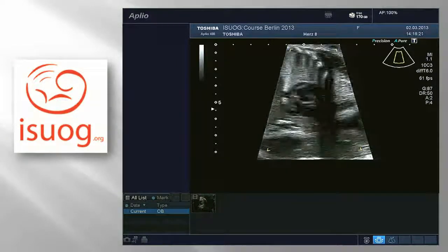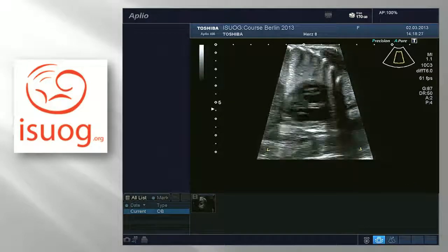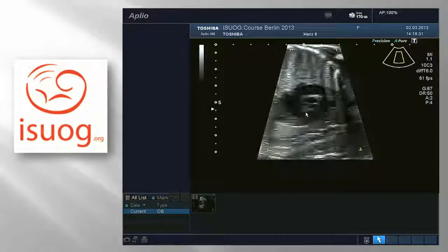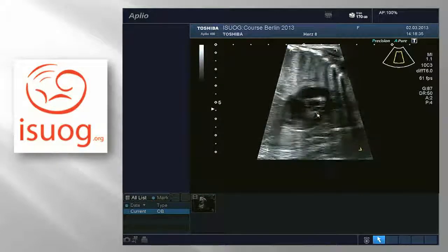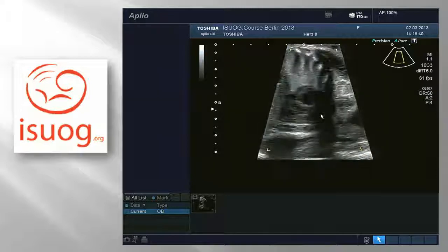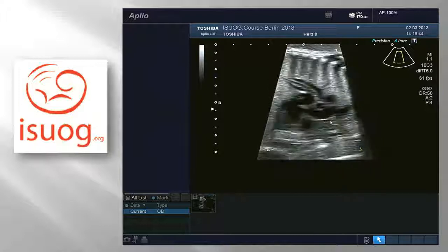So we have the short axis through the valves going to the papillary muscles of the left ventricle. There are two of them, nicely placed here. The right ventricular outflow tract. And then with a little bit of tilting, we should get the aortic valve in the cross-section, and the pulmonary valve. I need to adjust to try and get my aortic arch.